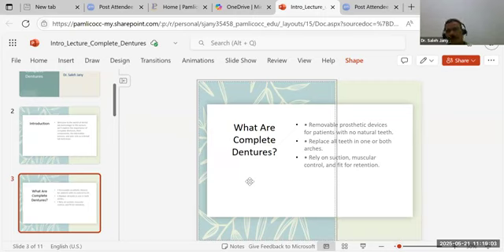We can do it fixed and we can do it over denture. Do you know what's over denture? Is that where it snaps into the... Yeah, it snaps on either ball or socket of implant, or you can do the canine.